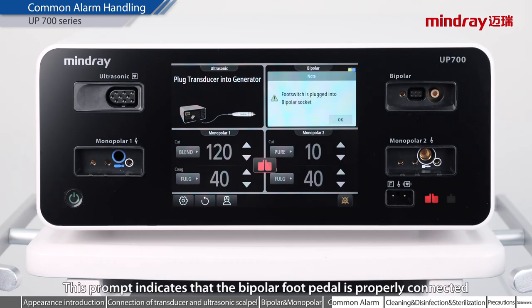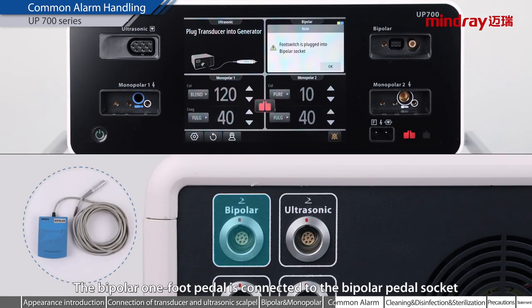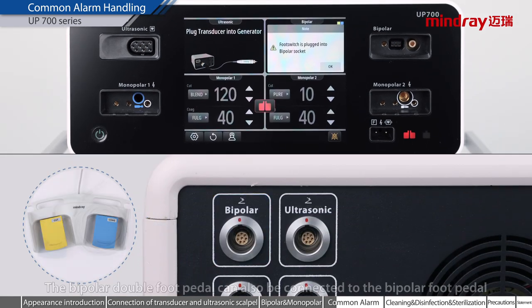This prompt indicates that the bipolar foot pedal is properly connected. The bipolar 1 foot pedal is connected to the bipolar pedal socket. The bipolar double foot pedal can also be connected to the bipolar foot pedal, but only the coagulation function is supported.